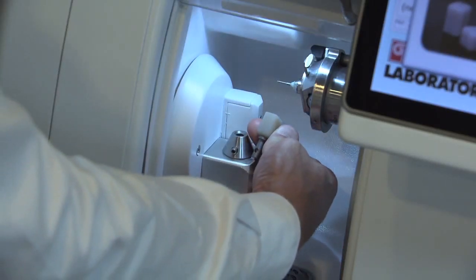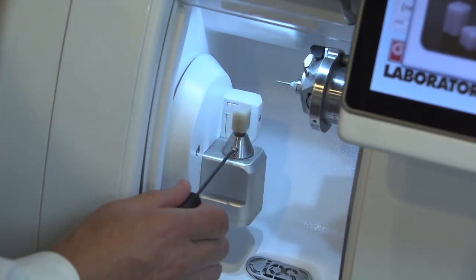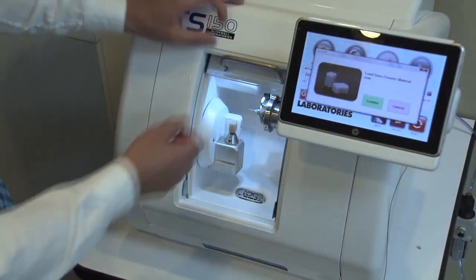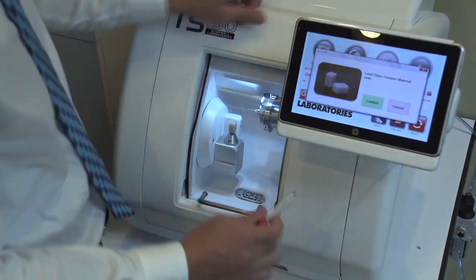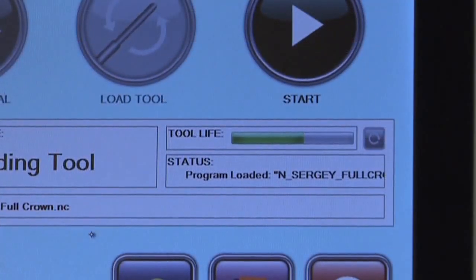Orient the pilot hole in the block mandrel so that it is facing towards the front of the mill. Use the supplied Allen wrench to tighten the clamping screw. Once the material is loaded, slide the mill door closed and press the Loaded button.